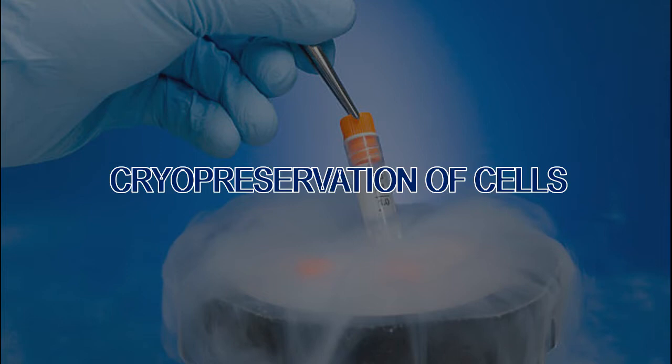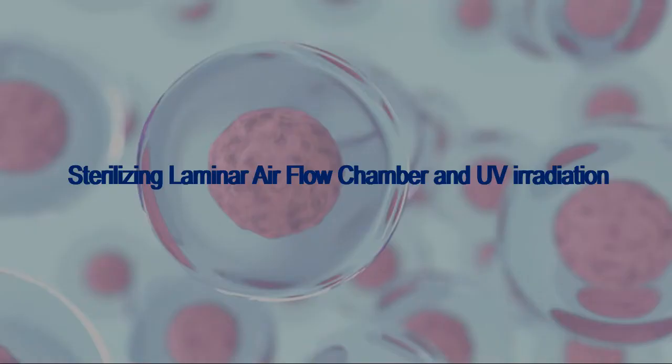Dear students, today we are going to learn about cryopreservation of mammalian cells. Mammalian cells can be cryopreserved and maintained for many years by careful preparation. This protocol can be used to successfully cryopreserve primary, normal, or continuous cell types from either anchorage-dependent or suspension growth systems. Let us start the experiment.